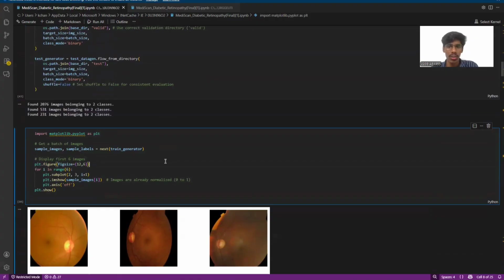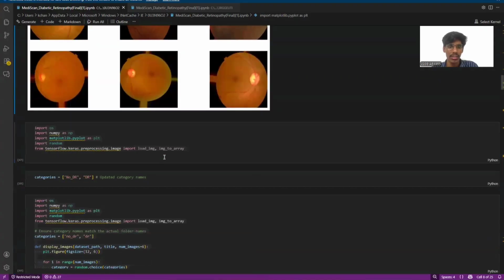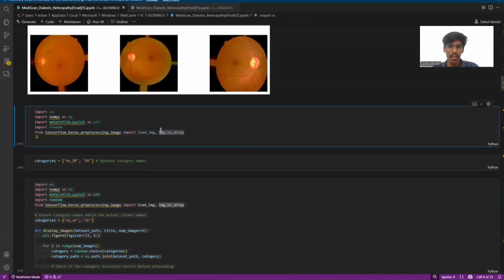In this cell, the code grabs a single batch of prepared images from the training generator and displays the first six of them in a grid. It allows you to visually verify that your data is loading correctly and lets you see the exact effects of your augmentation settings on the images. In this code, it imports libraries like NumPy, loads the dataset, and displays specific images from your dataset. It gives you the tools to convert image files into numerical arrays so you can visualize and inspect them individually.